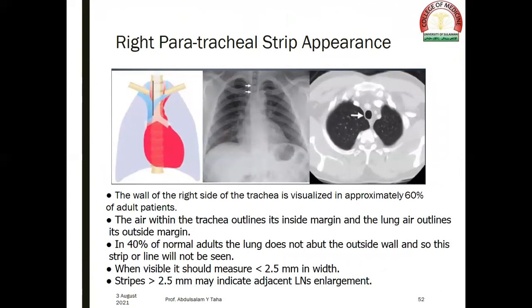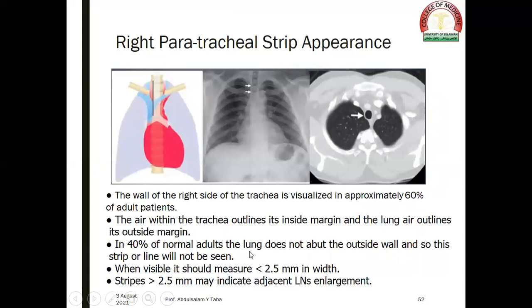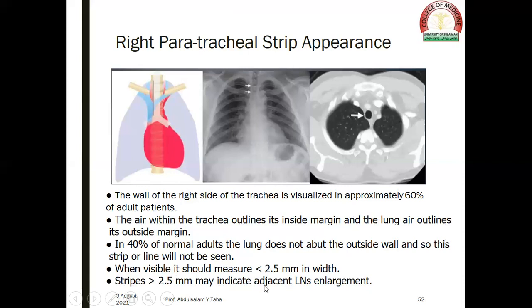The right paratracheal strip: the wall of the right side of the trachea is visualized in approximately 60% of adult patients. The air within the trachea outlines its inside margin and the lung air outlines its outside margin. In 40% of normal adults, the lung doesn't abut the outside wall, so this strip will not be seen. When the right paratracheal strip is visible, it should measure less than 2.5 mm in width. If it is more than 2.5 mm, it may indicate adjacent paratracheal lymph node enlargement.